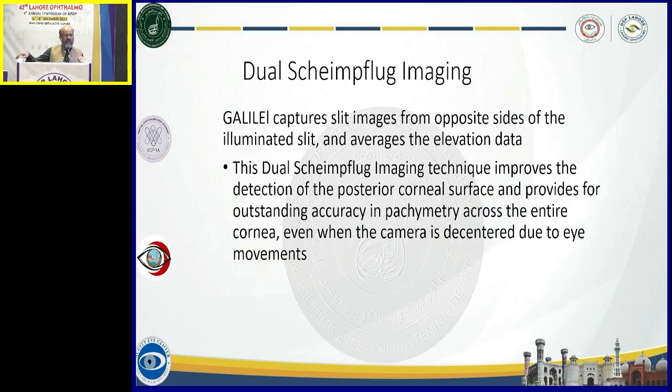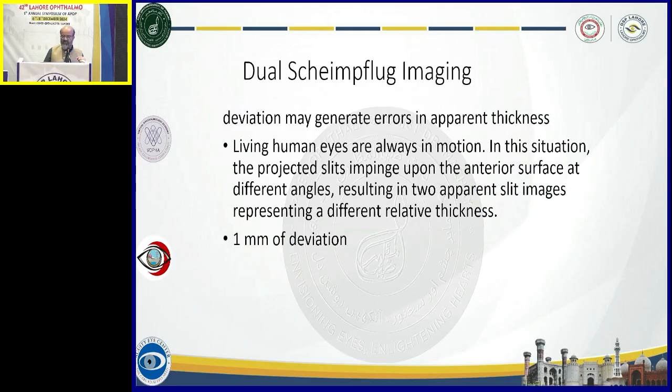These things are almost common to Pentacam and Galilei, because the Pentacam also uses the Scheimpflug principle. The OPD-Scan by NIDEK probably has this limitation, and the Placido based scans also have a limitation in that they are not able to analyze the posterior corneal surface effectively.